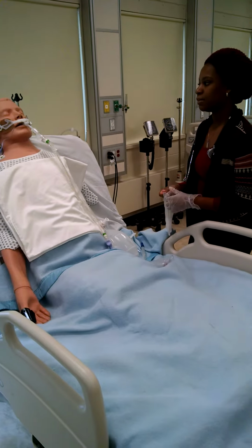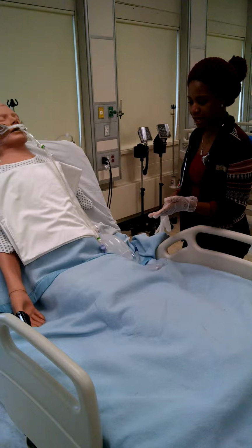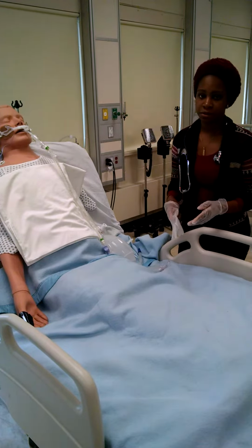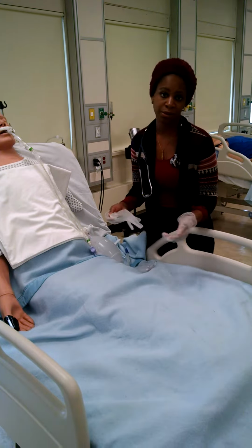And after I verify his name and date of birth, I will go ahead and check his pulse ox, his heart rate, and his respiratory rate, and make sure that he's responsive by asking him to squeeze my hand and maybe wiggle his toes.